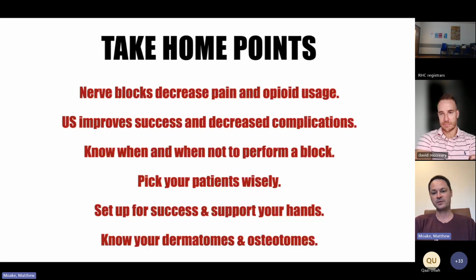He had a needle in his foot that we went after, and mom asked, while we're in procedures, will you let us know when you start the procedure? And I already had a hemostat buried in the kid's foot, and he had no idea whatsoever. So it was just fantastic. Saved a sedation. Really good for patients.